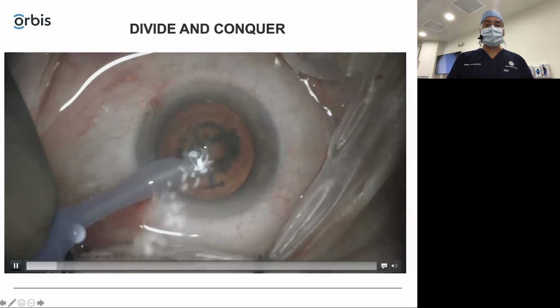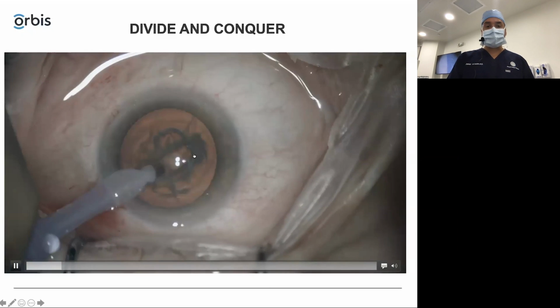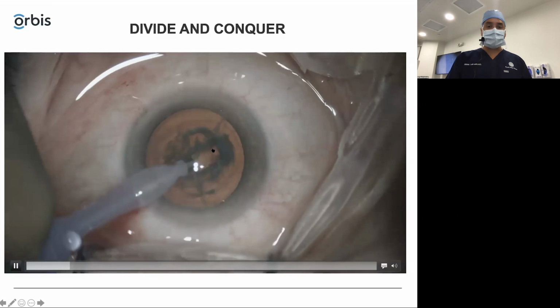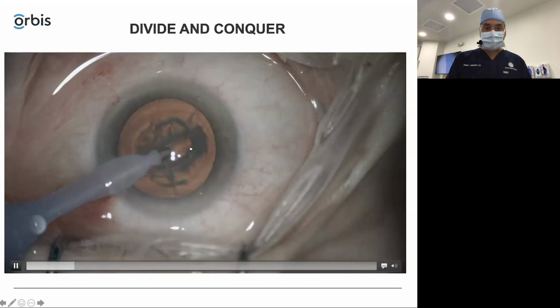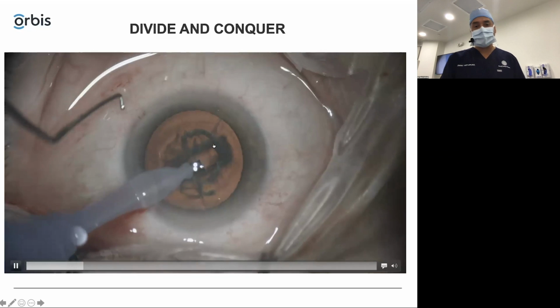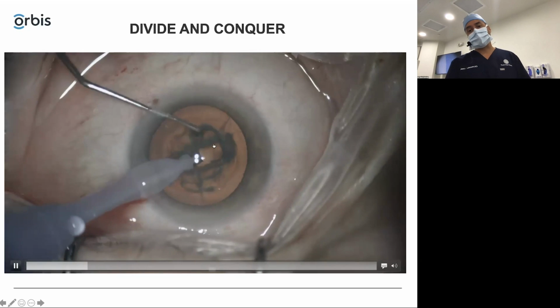And how deep do you want to go? You want to go until you can start to see striations in the lens there. That lets you know the right depth. So right there, you can see with the reflection, you can see these little striations there. That's how you know you're about 80%. And then you can go in with your second instrument and crack it.